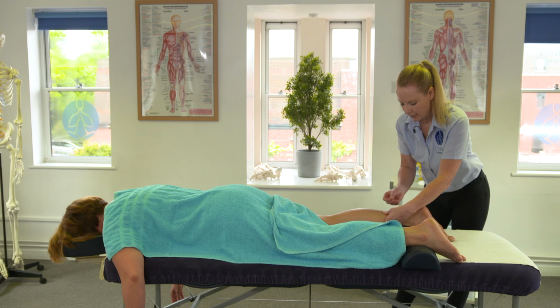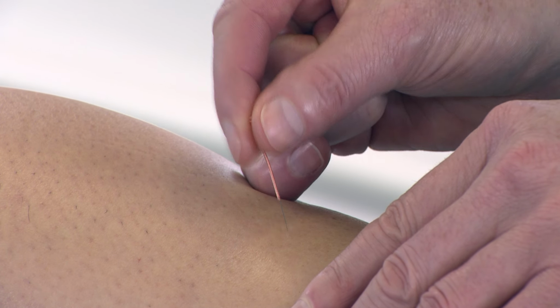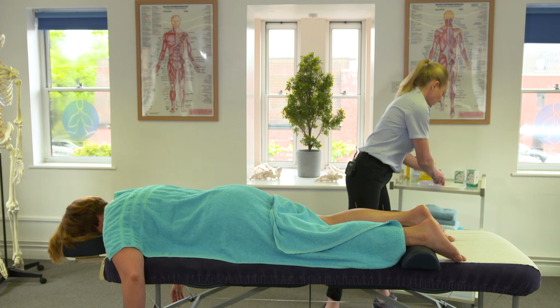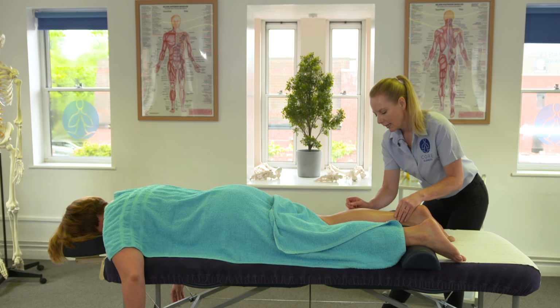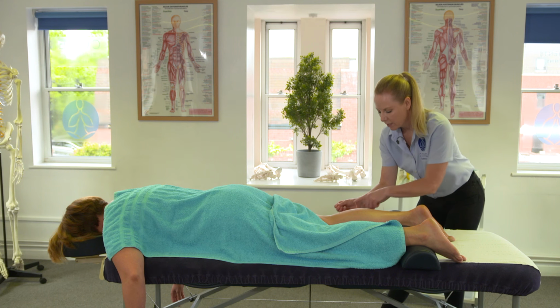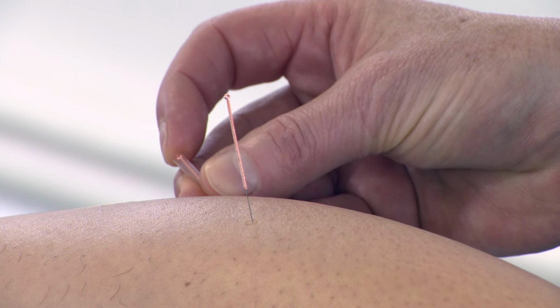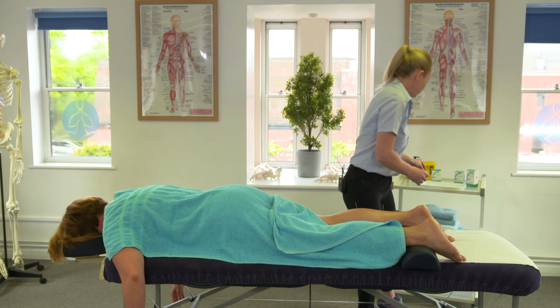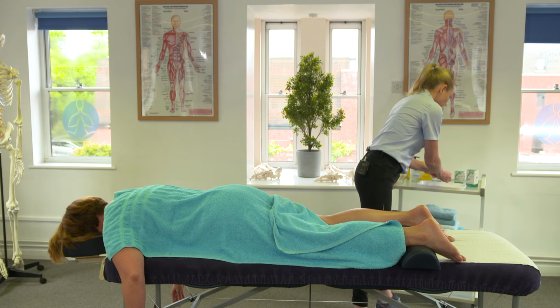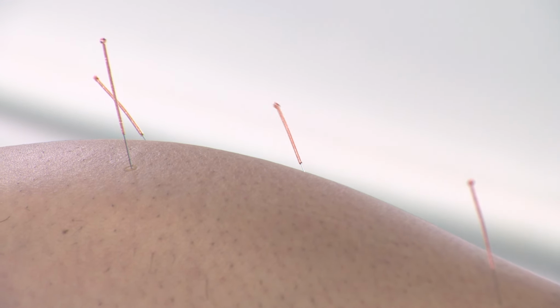So I'm now coming down to soleus using that same technique. Pressing that needle in and then pushing the needle down roughly about half the length of the needle. And then I'm going to place two needles onto the lateral part of the tissue. In this one, I know that through palpation I can identify that Katie has a line of tension. So I'm going to angle my needle and go in a more longitudinal direction, through the length of those muscle fibres. And then our final needle for this area today, coming slightly lower where Katie again still has a line of tension, and placing that needle in.